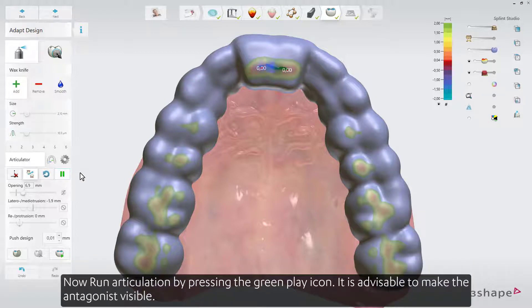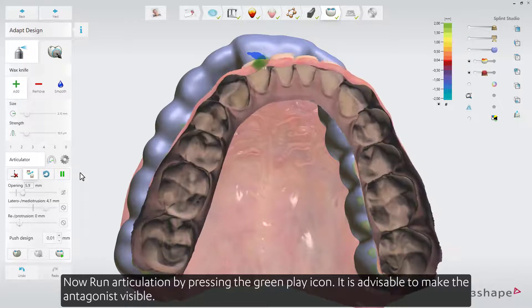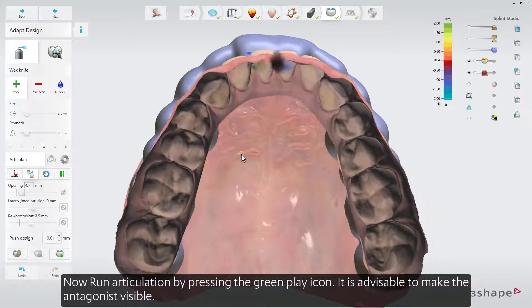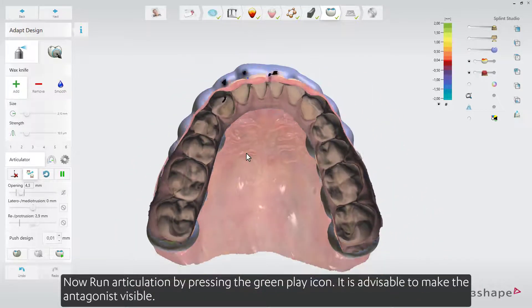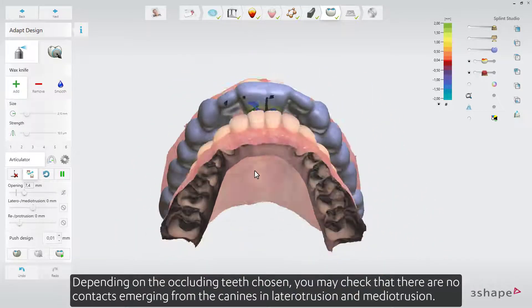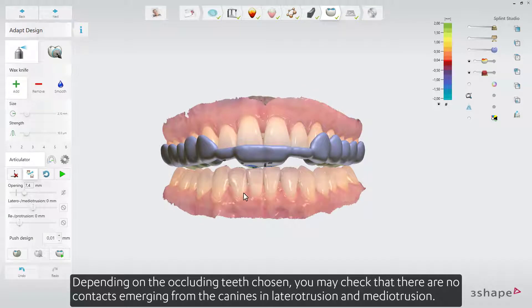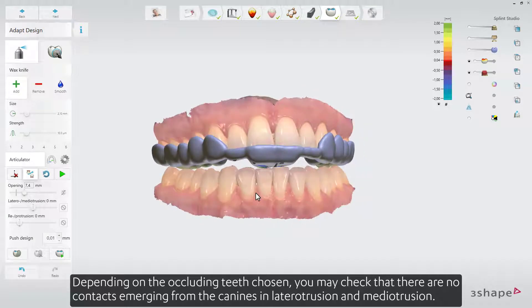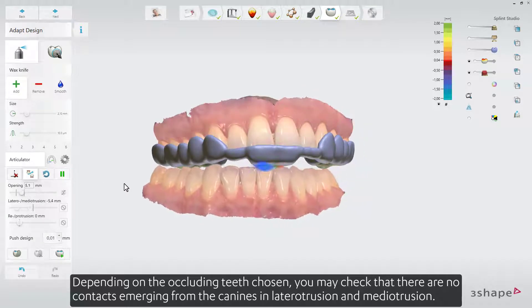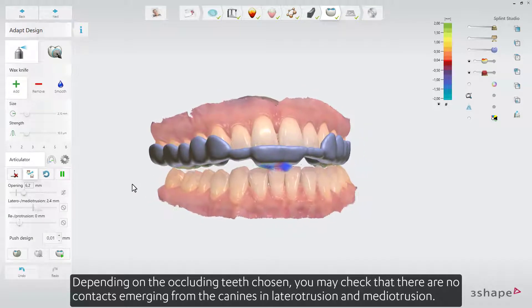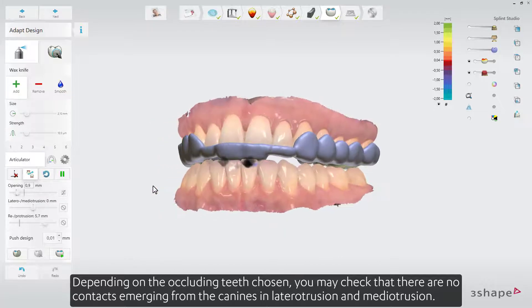Now run Articulation by pressing the green play icon. It is advisable to make the antagonist visible. Depending on the occluding teeth chosen, you may check that there are no contacts emerging from the canines in Laterotrusion and Mediotrusion.